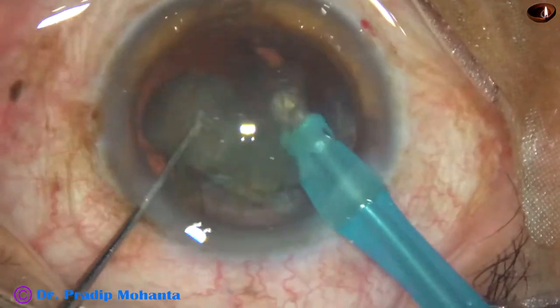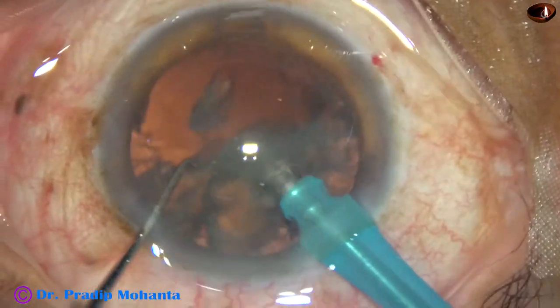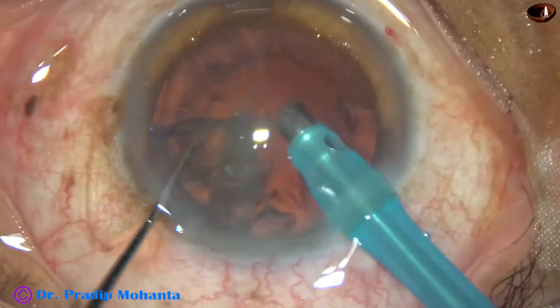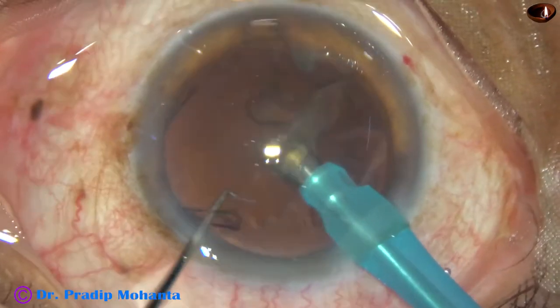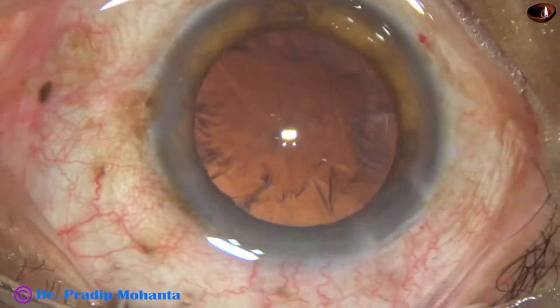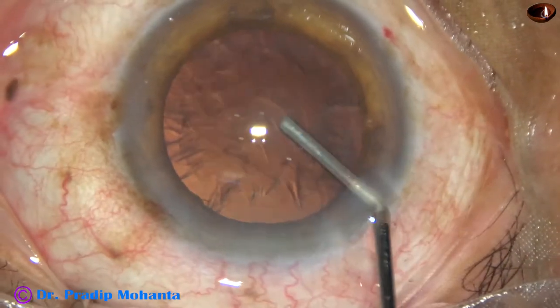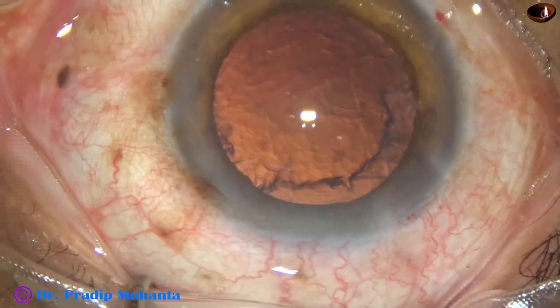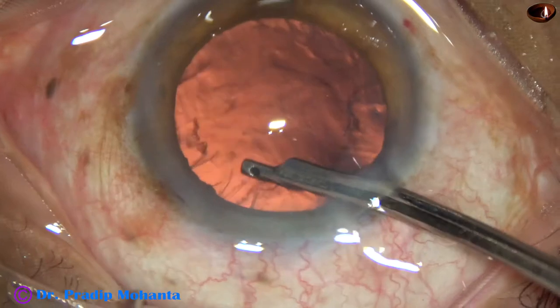Now after dividing the nucleus mechanically without using vacuum, the nuclear fragments are emulsified and taken out. Phaco power used in this case is 60 percent, flow rate is 45 ml per minute, vacuum is 450 mmHg, the machine is Faros from Oertly, and the microscope is OMS-800 from Topcon.